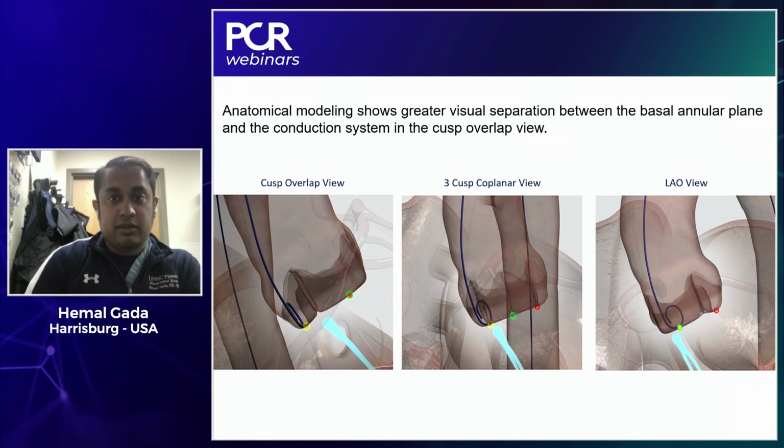The conduction system is not foreshortened, which is precisely what Nico had talked about, with the elongation of the left ventricular outflow tract and the elongation of the anatomy below the non-right commissure. We actually get distance both between our non-coronary cusp pigtail and the insertion of the non-coronary cusp, with the conduction fibers that emanate below the AV node.